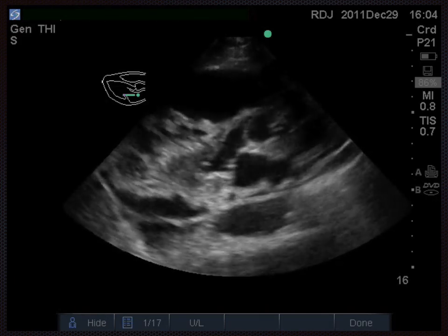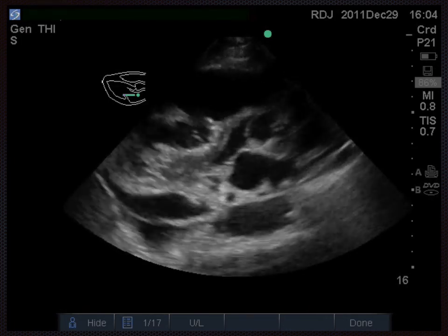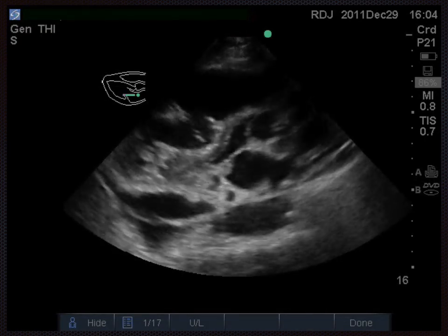Okay, so D for dimensions, well, that's been quite useful so far. We've made an assessment that we've got a narrowed and small left atrium and also left ventricle. In fact, the left ventricle walls look like they're almost touching each other in systole. The next thing we're going to do is now move on to E for effort. So really, is our heart pumping well?